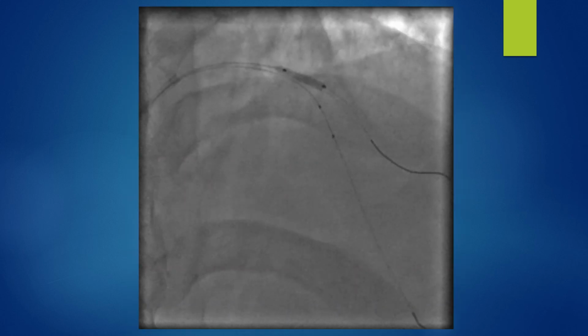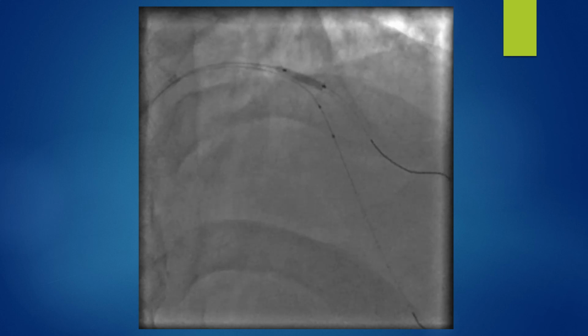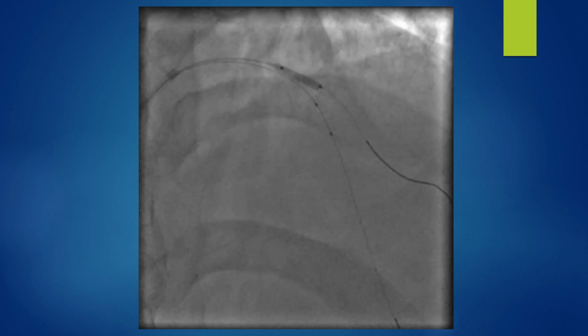Before I deployed the stent in the diagonal branch, I made sure that my LAD balloon is past the stent in the diagonal branch. So then I deployed the stent in the diagonal branch.